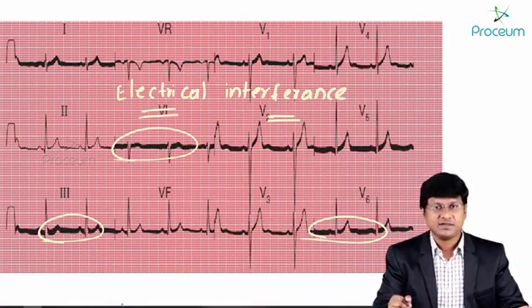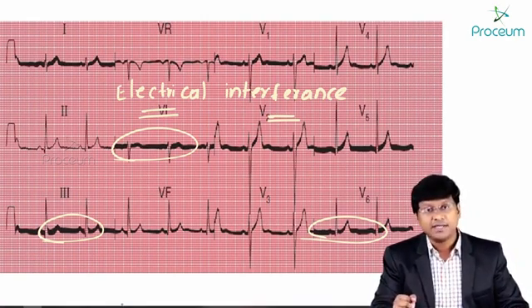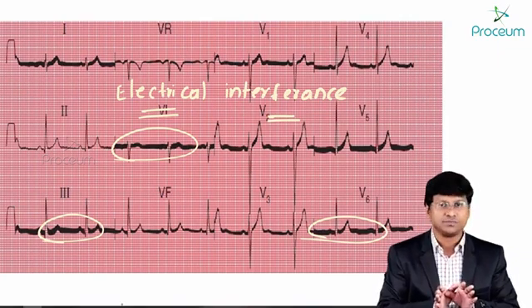In such a case, what will your electrodes do? Electrodes will pick up the electrical activity of these surrounding objects also.